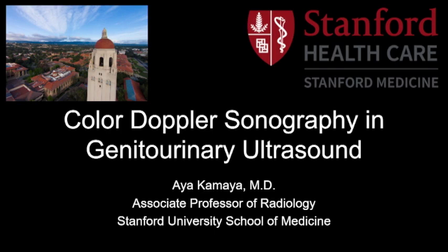So I'm going to be talking about color Doppler sonography in GU ultrasound.